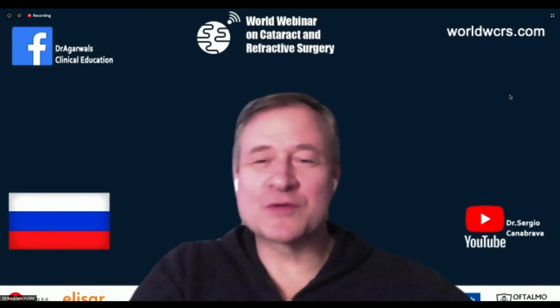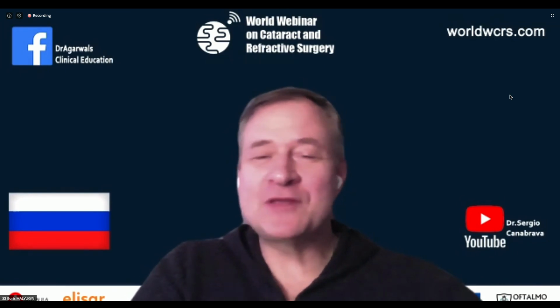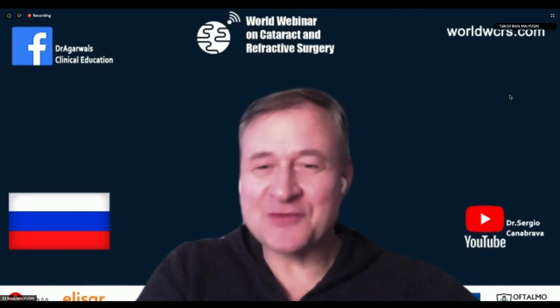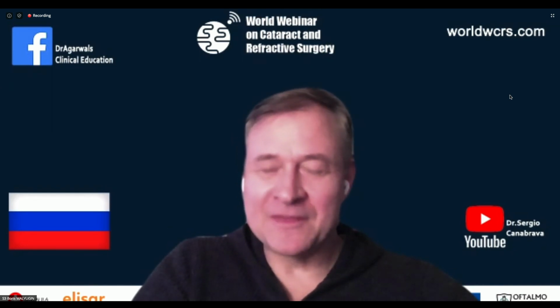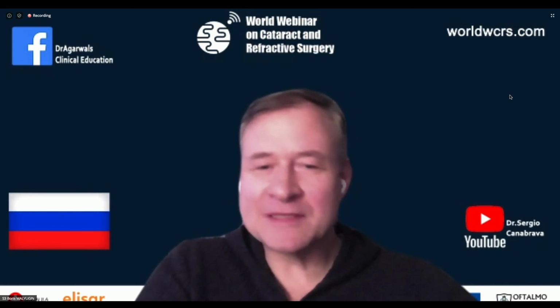I agree with what was just said, and I think when you try to expand the pupil when you have already done the capsulorhexis, whether you use the ring or the hooks, there is a risk of catching the rhexis margin, and obviously you have to keep that in mind. At least in my hands, I think it's a good idea to lift the iris a little bit.